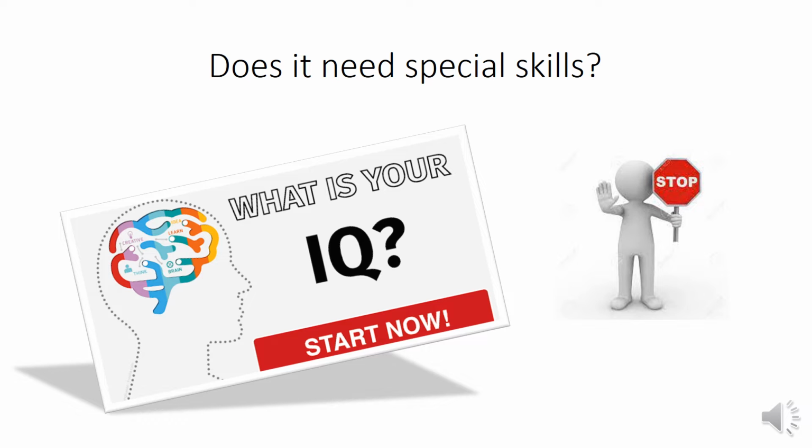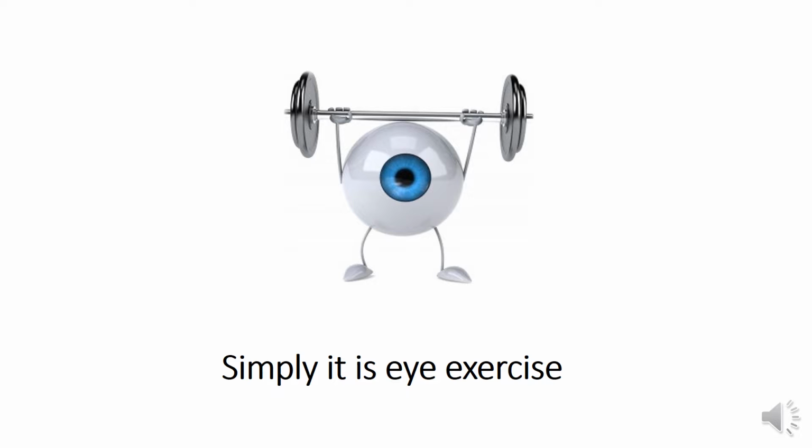So back to our talk. Does interpretation of coronary angiography need special skills? Actually, it is simply an eye exercise. The more you see, the more quickly you can identify coronary anatomy and comment on the lesion. So at the start, you should be familiar with coronary anatomy.